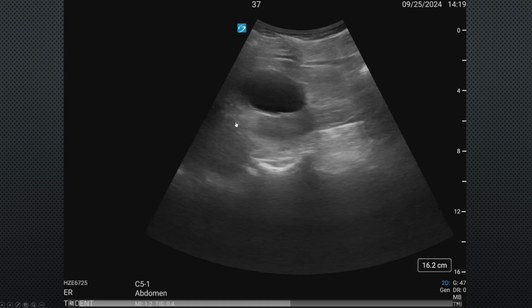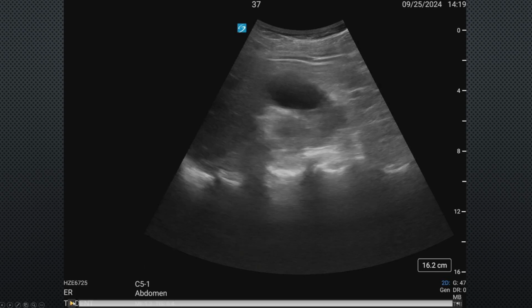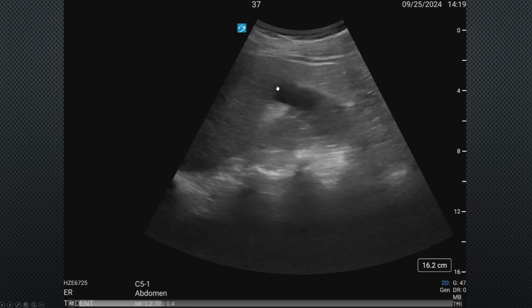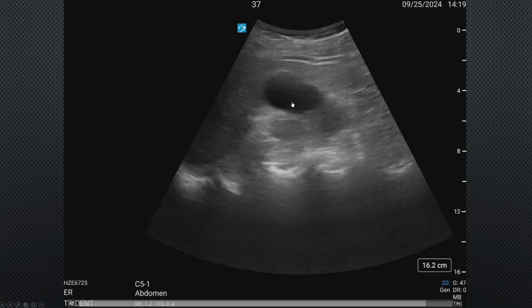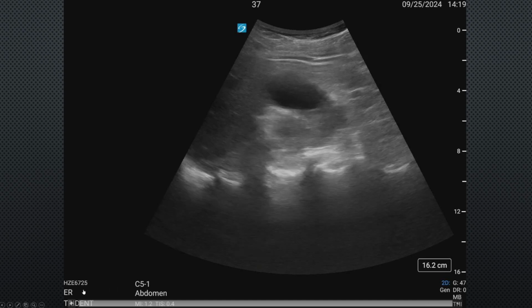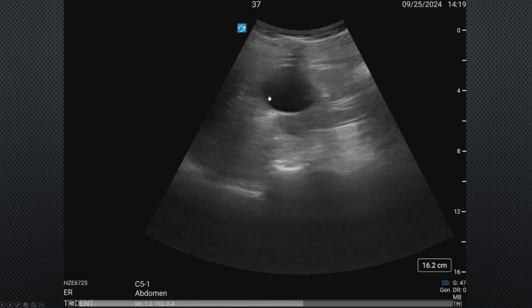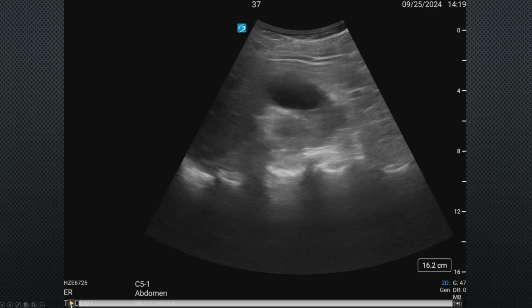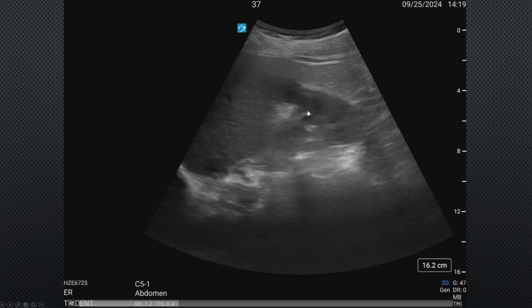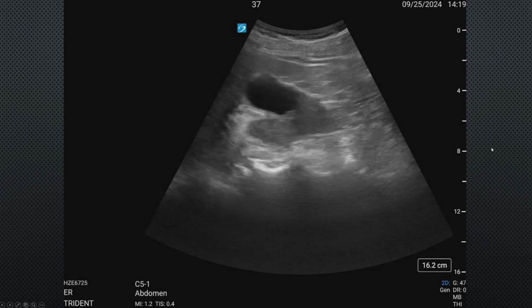Now this is an interesting one that one of our residents did. As we can see, not a great first view. We see a large circular hypoechoic structure. Can't quite tell at this point what it is. It could be the gallbladder, right under that liver in the right upper quadrant. So it could be that, but also pretty close to the kidney. So we'll need to take, as I like to say, that second view look.